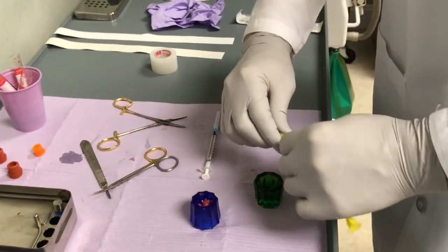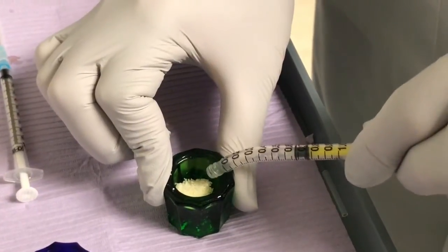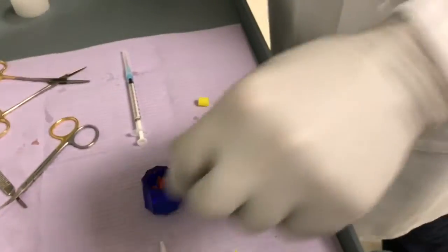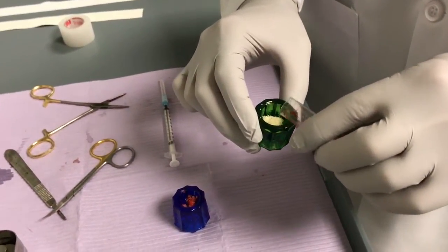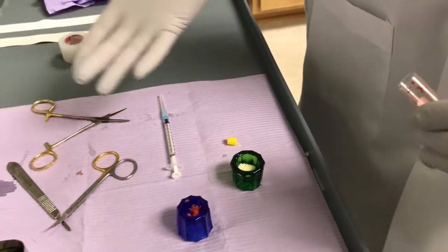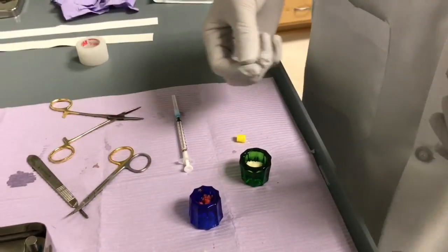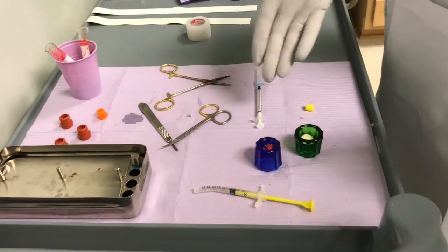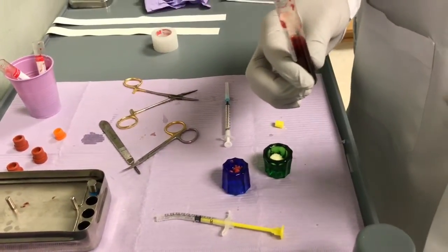The bone graft material looks a lot like kosher salt. In the past, we would put it in a dish — this is a product that can be purchased from a pharmaceutical company, and in this case it's a human cadaver bone. Before we had platelet technology, we would take the product from the pharmaceutical company, put a little bit of sterile water in there, and mix it with a little bit of blood from the patient's mouth to get a pH balance and place it. These crystals can be really difficult to manipulate — they can fall out of place and really lack a lot of the growth factors, which is really the whole point of this platelet treatment.